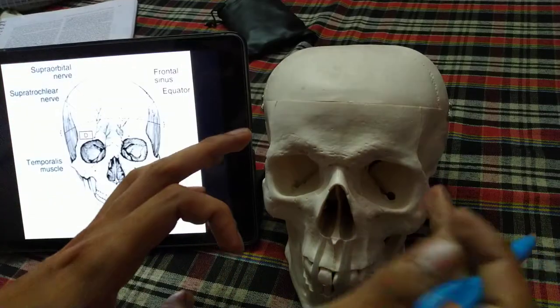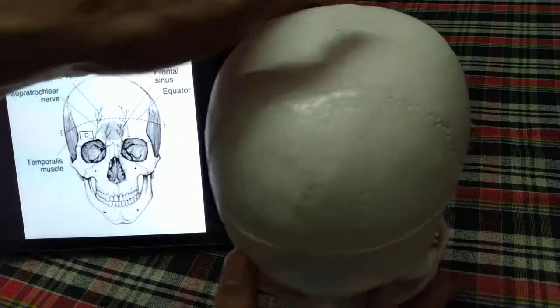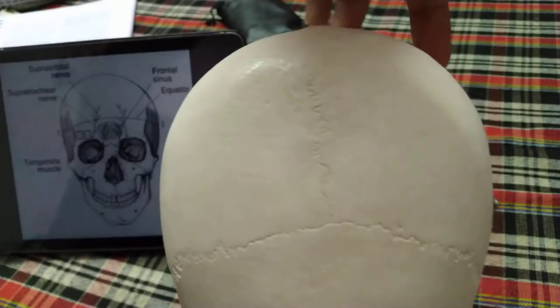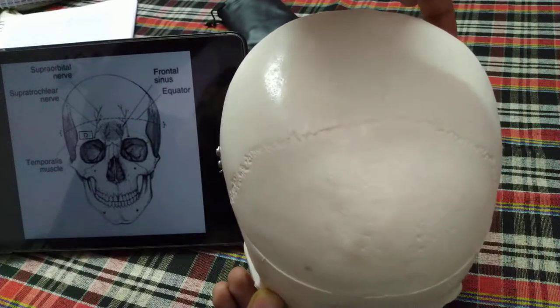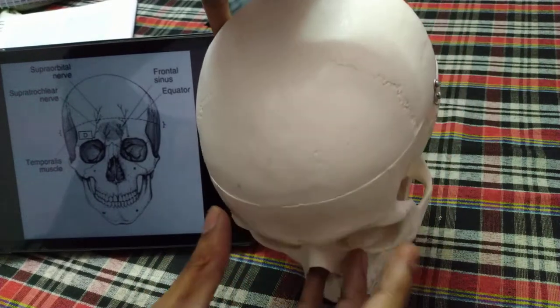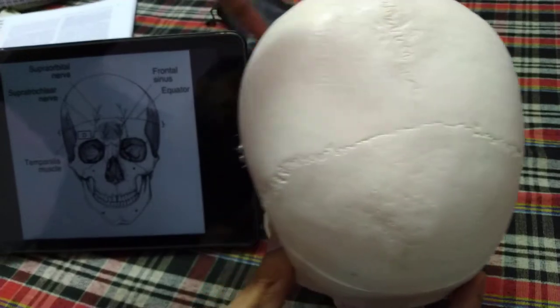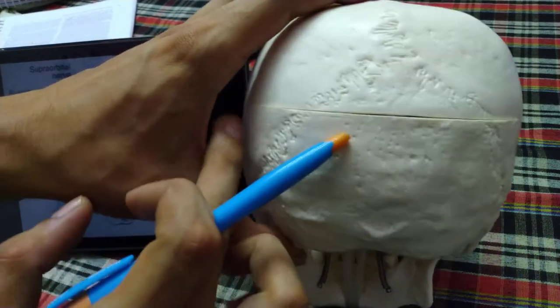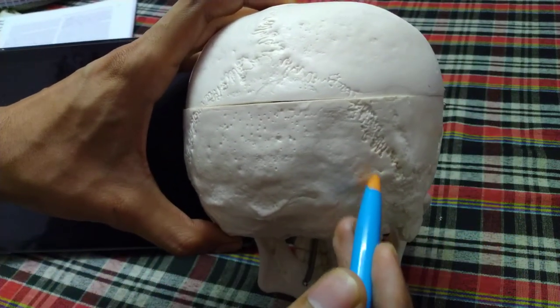The posterior pins should be placed directly at 180 degrees to the anterior pins — one on each side. Posteriorly, the pin placement should be below the equator of the skull, at 180 degrees to the corresponding anterior pin.